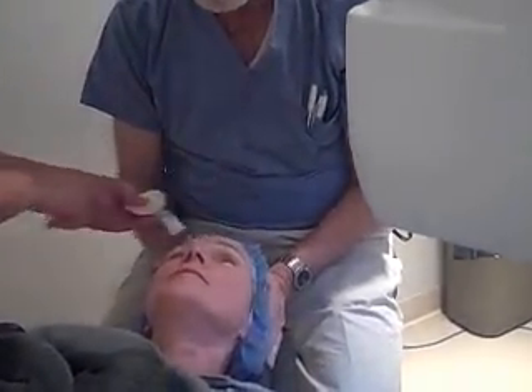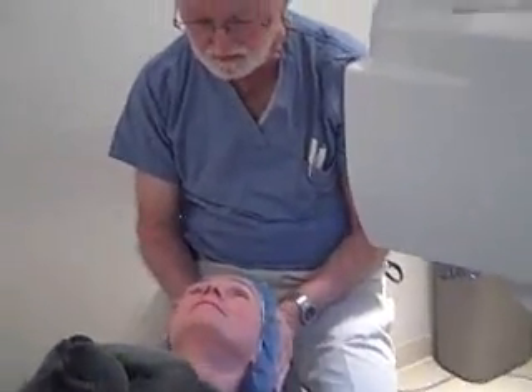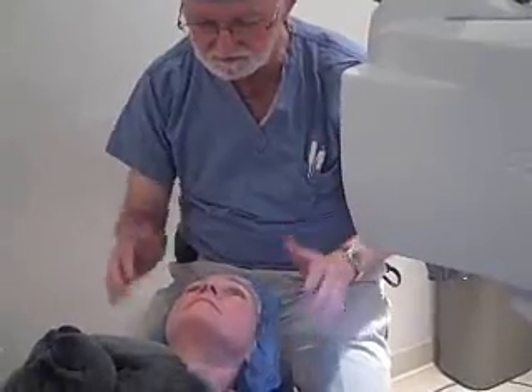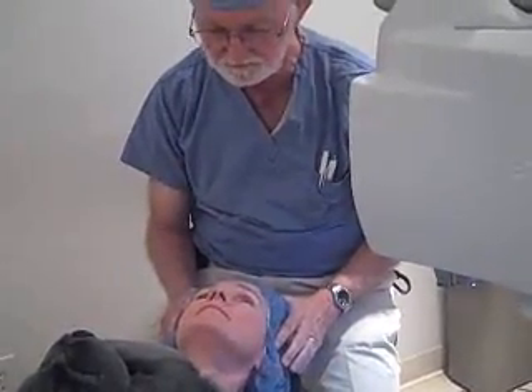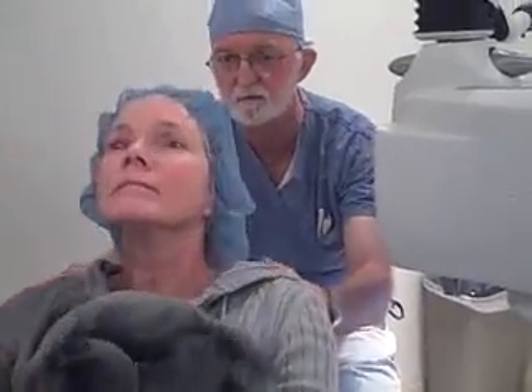Okay, what do you think? Was it as bad as I said? No, it was just what you said — not too bad. So we want you to sit up slowly. Don't stand up too fast because sometimes you're a little dizzy. Do you feel okay? Yes. Sit up slowly. You'll be all blurry now from all the bubbles.